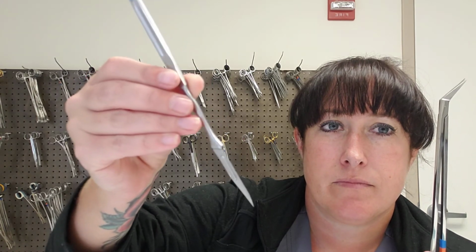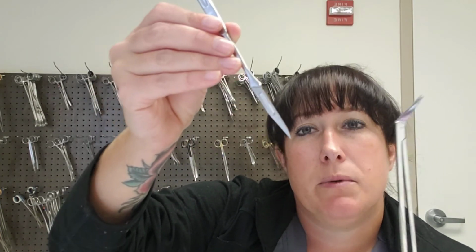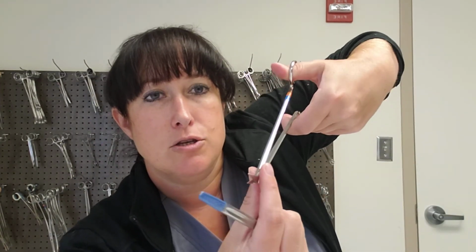Remember how we were talking about the 11 blade on the 7 handle? An arteriotomy would be made with this little pokey part, and then they'd use this to extend that arteriotomy. So that's what these are for.